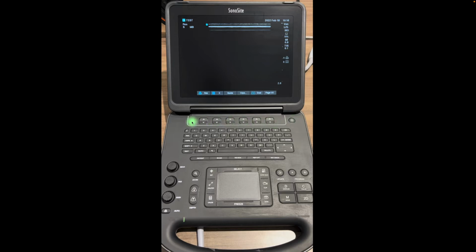We also have these up and down arrows, and they actually relate to the labels here on the screen. So when you select these analog buttons, it actually is telling you the function here on the lower screen. You'll notice that there's page 1 out of 2. That means if you push this up arrow, you actually get to a whole other page of buttons here. And this can be used to have a dual screen, to add a guideline, as well as to change the dot in the upper left corner.